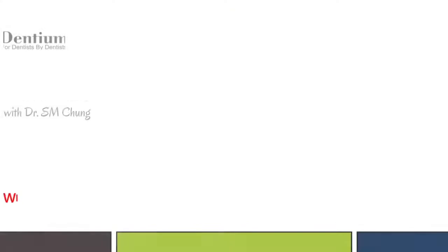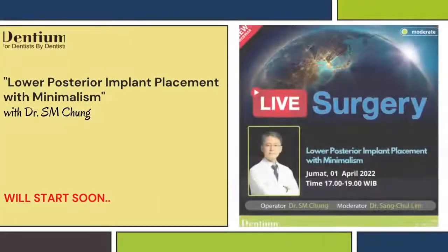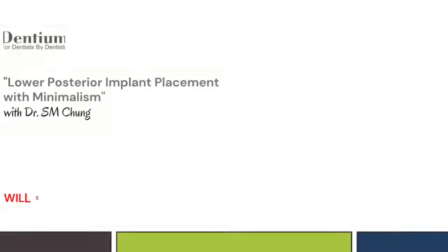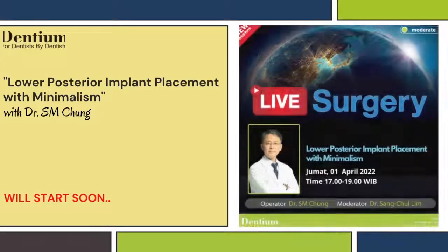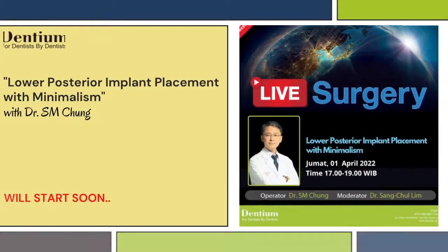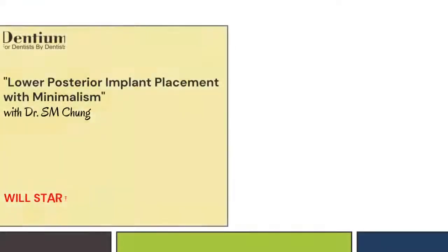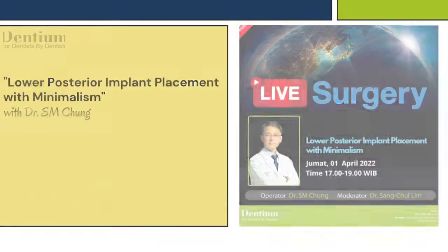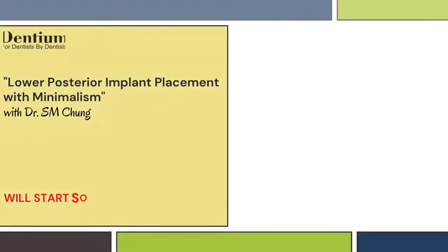This tissue level implant has a thin and deep thread design, as you can see, so we can easily get higher insertion torque and primary stability when we have softer bone, right?